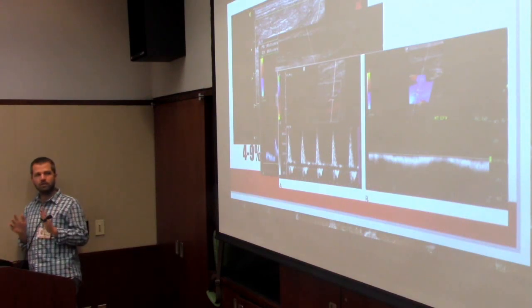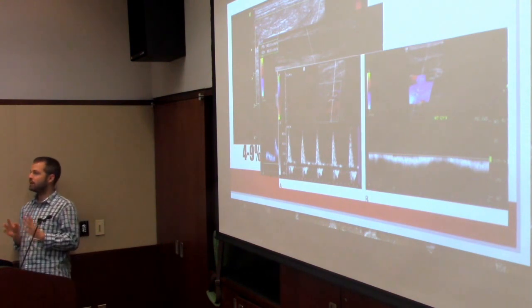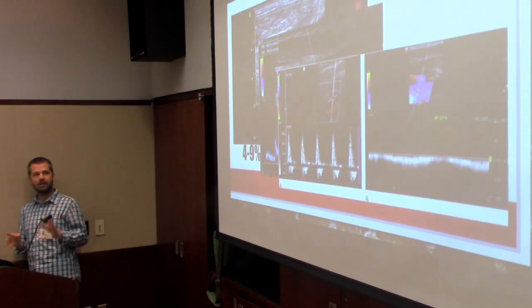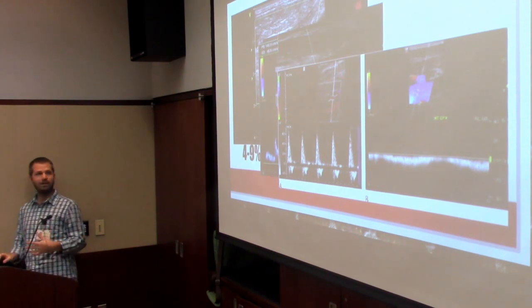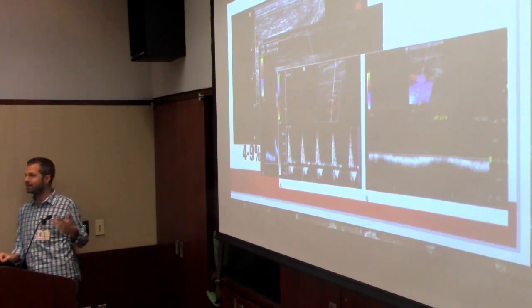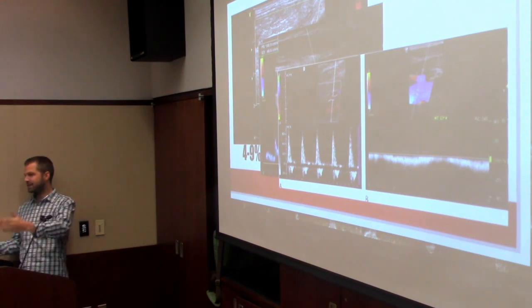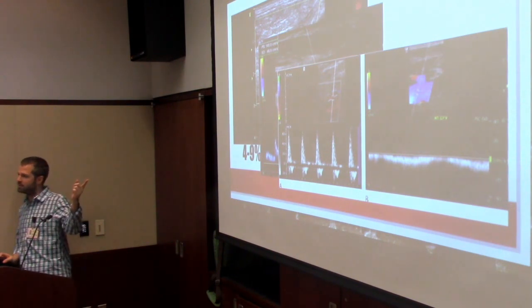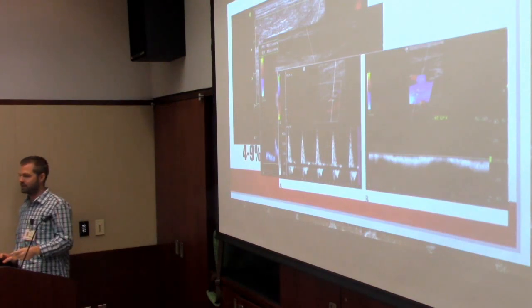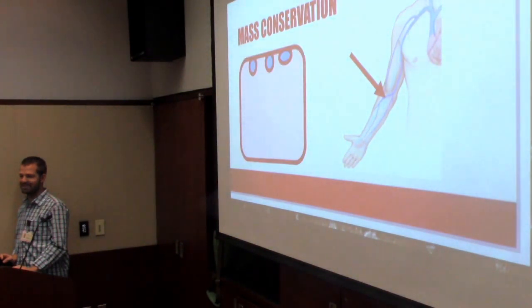And if all you do is look for the vein, you're gonna screw up. If all you do is look for the artery, you're gonna screw up. Look for both, convince yourself with evidence that one is one and one is the other, and separate them. Compare them. How are they different? Visualization, Doppler, listening, compressibility, the appearance of the vessel, you have to use all of these things, not just, look, it's red, it's left, it's bigger. You can't pick one or two things. Because you don't want to be part of this 4 to 9% of people who's just stabbing someone's artery because you couldn't figure out the difference. Justin, man, with your master of physics, you're ready to take your physics RDMS test now.